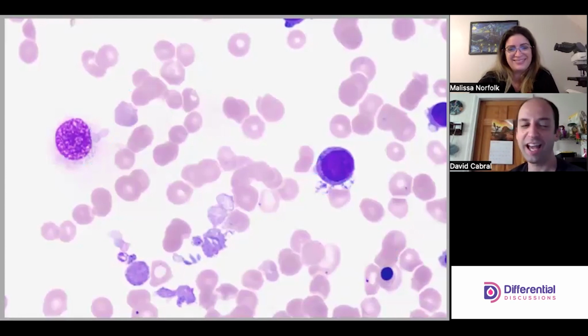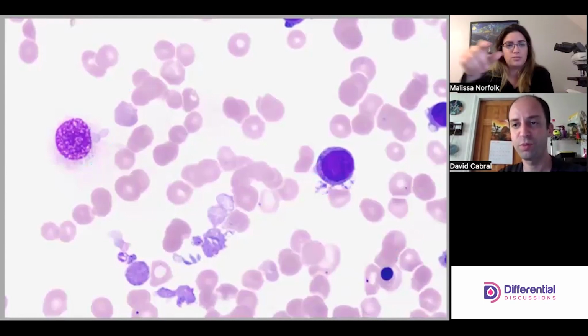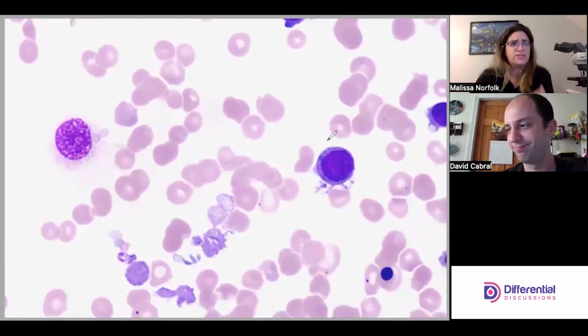Absolutely. A lot of times on this channel we're talking about nuclear chromatin. I think the job gets a lot easier with these, in that it doesn't matter what the nucleus is doing. We care about the cytoplasm here. The other thing is that with a lot of these cells, this cell in particular and its clones, the nucleus is so dark that you really can't see the features. And that, I guess, in itself is a feature of this cell and its clones.